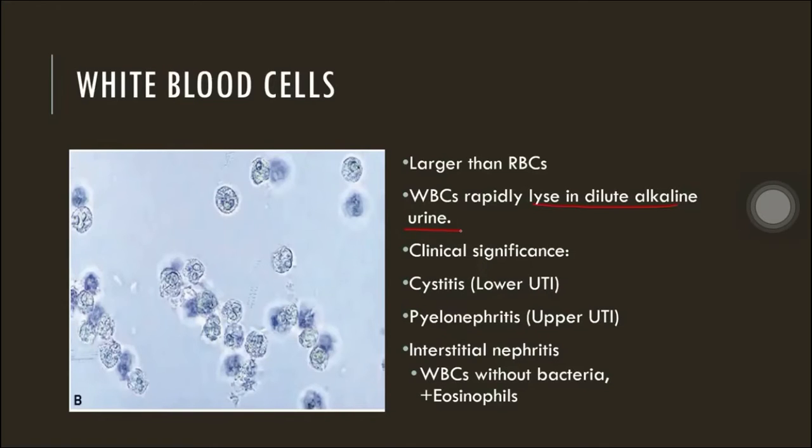On the third slide of the first video, we talked about the changes in unpreserved urine. If the specimen is left standing for a prolonged time or left at room temperature, sediments like RBC, WBC, and casts may disintegrate or lyse in the presence of dilute or alkaline urine.